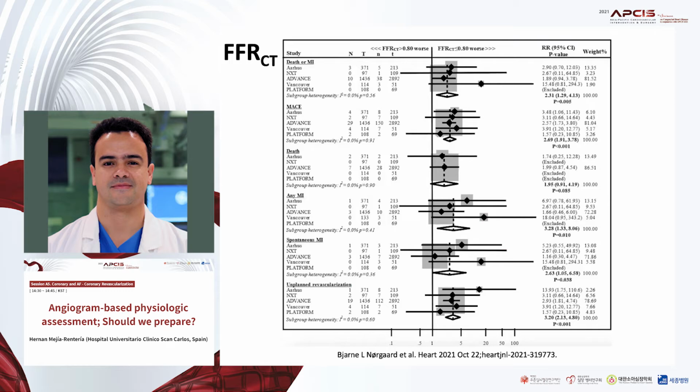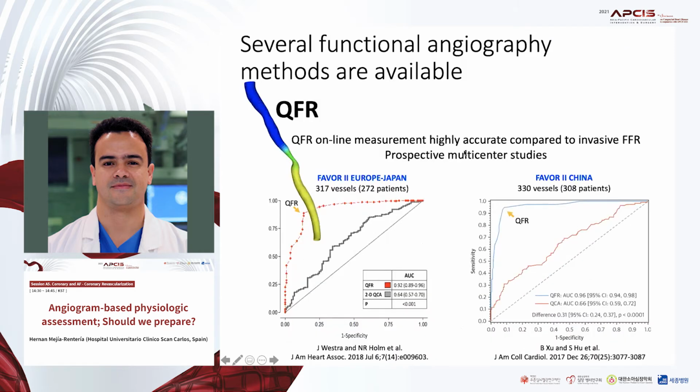FFR-CT has demonstrated its clinical value by predicting clinical outcomes. And it is accepted that the integration of FFR-CT in the diagnostic workflow may help in clinical decision making. On the other hand, on the grounds of invasive angiography, we have several techniques.